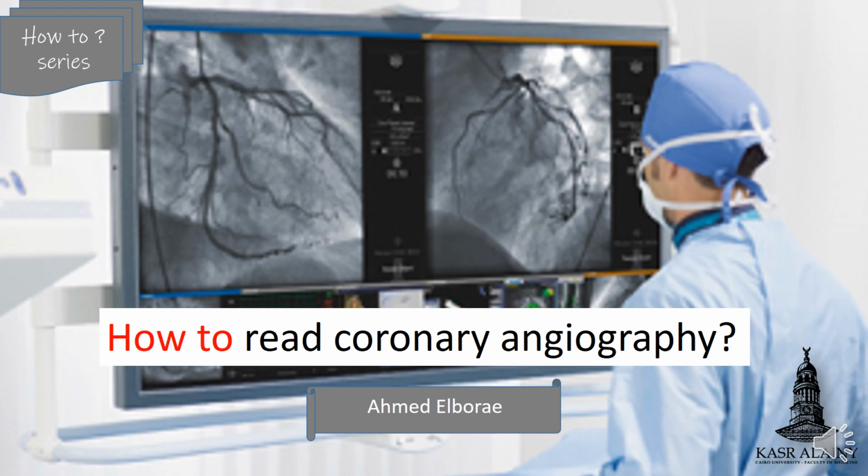Good evening, my dear colleagues. We will talk today about an important topic for every cardiologist: how to read coronary angiography.